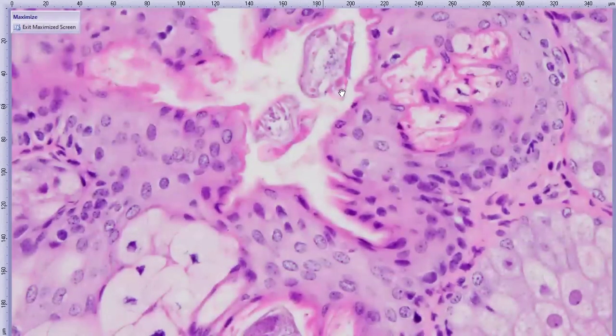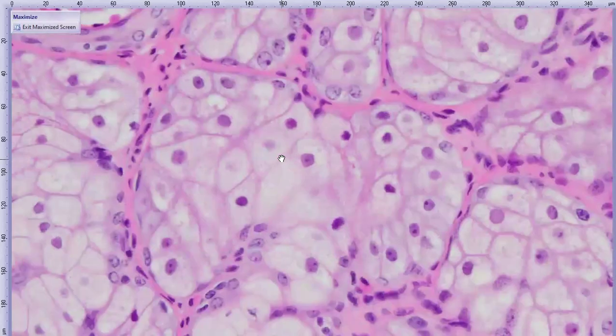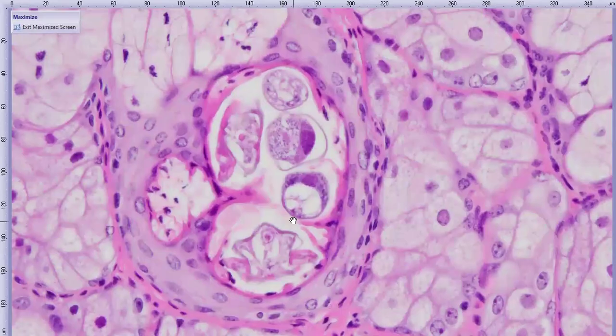Little jointed appendages, muscle. So very cute and adorable. These are often an incidental finding. Sometimes they can be associated with clinical disease, but oftentimes they're subclinical or incidental, and they're just fun to catch on section when we have them.